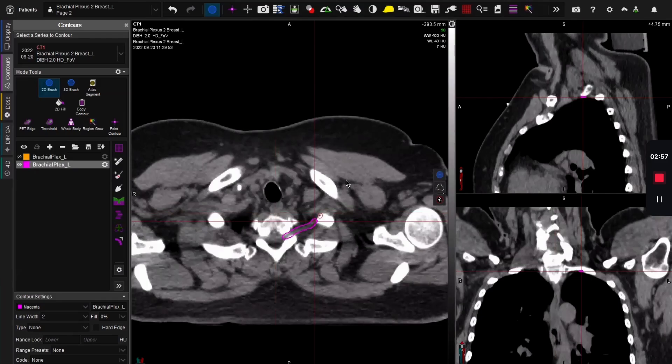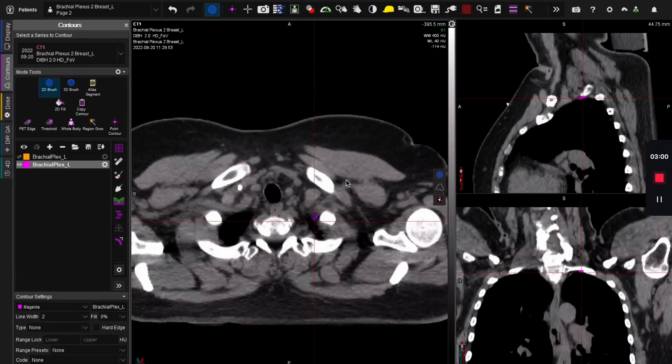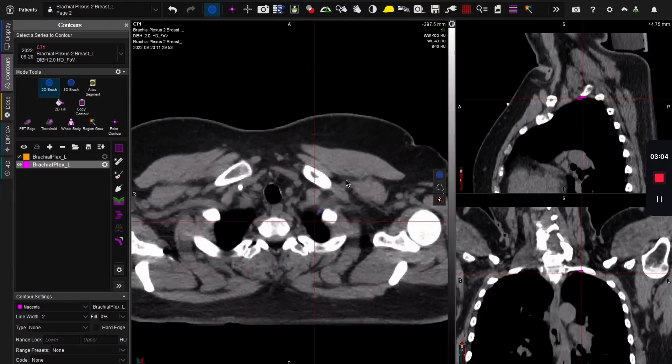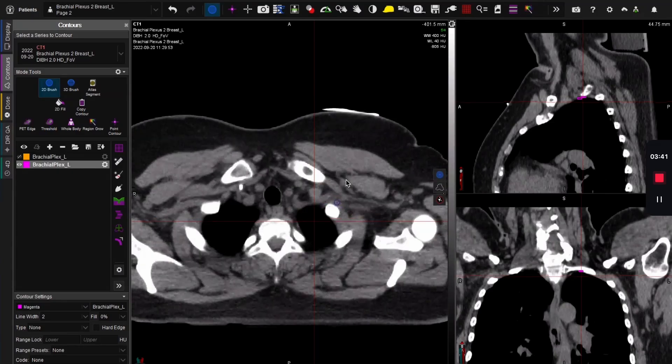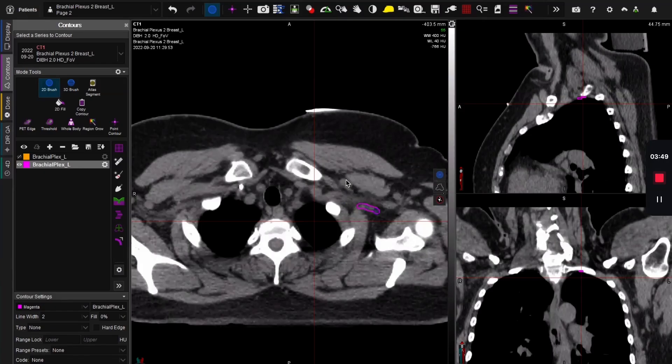I'm going to go down a slice now and follow it here. Down another slice, follow it here. As you can see, it's starting to get pretty horizontal. How do I know this is the brachial plexus as opposed to the other structures nearby? Remember: vein, artery, nerve — from the outside in, you have the vein, then the artery, then the nerve. So the nerve is always going to be the structure closest to the inside. I've got my nerve here and I'm pretty happy with that.